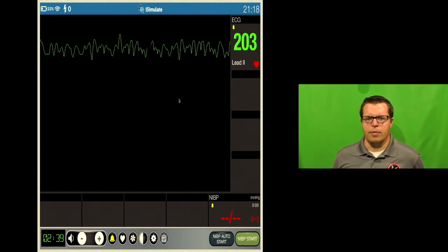And if you try to blow off that CO2 and get it down to a quote-unquote normal value of 45, then not only are you really going to be working the ventilator pretty hard and potentially causing a lot of problems for the patient, it doesn't need to be there, because the patient's used to hanging out at a CO2 of 70 or 80. So in that case, you can hurt the patient by trying to make them better, just from the physical stress on their lungs, from the likelihood that you're going to have to increase the respiratory rate and potentially cause more barotrauma, potentially cause breath stacking in these COPD guys, and really hurt them in that way.